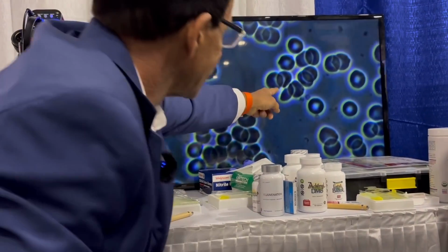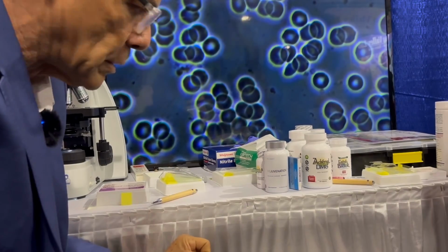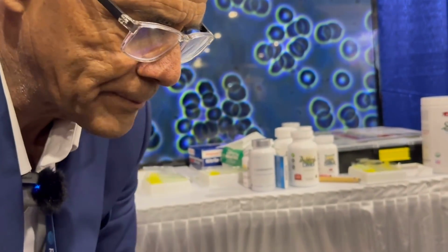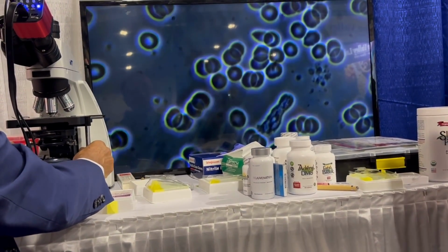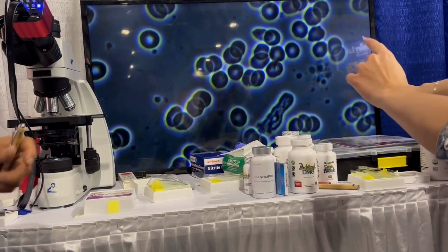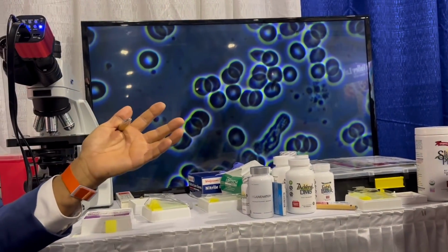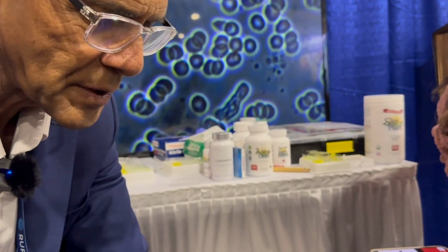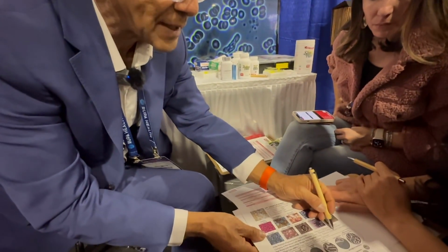And you notice how that cell is oval. Is it? Yeah, it looks like it. Okay, so we're gonna circle right here where it says oval cyte. I think we've only seen one so far. Oh, another one, look. Point to it, you see it? No, that's a white blood cell. On top of those? Right there. Oh. You see that? It looks oval to me, right? Okay. So there's a degree of the morphology, so there's some misshaped cells, oval shape.